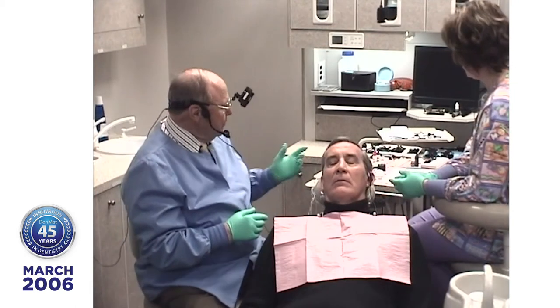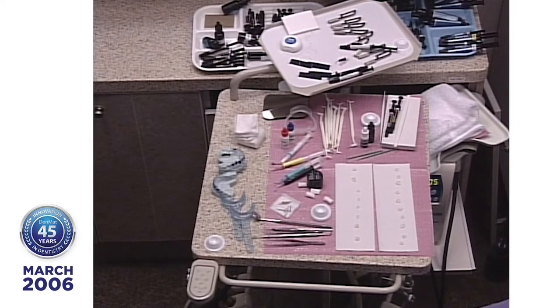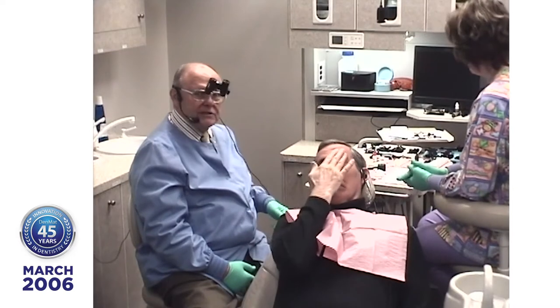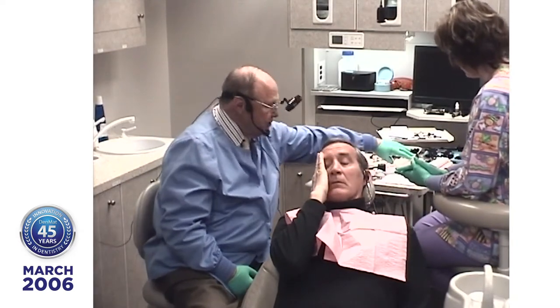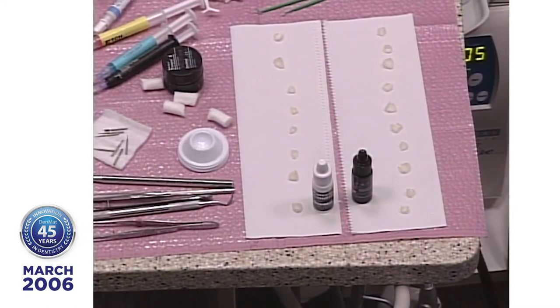So let's take a view at what Lisa's done before we got started here, because I just walked in and Lisa spent what takes about a half hour for you to do this and get everything set up. So at any rate, Lisa's got all these things out and she's pre-treated the porcelain. Now what she's done with the porcelain is put two solutions on it. And if you put two of the right solutions on, everything works. If you put one of the two or none of the right two, then nothing works.